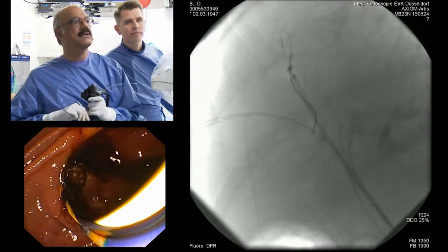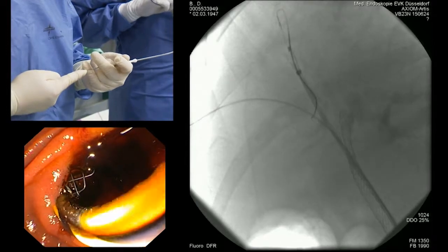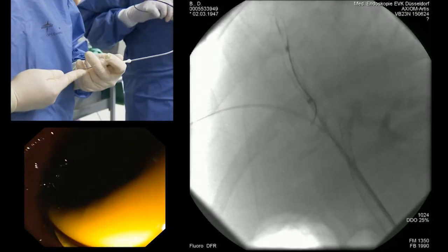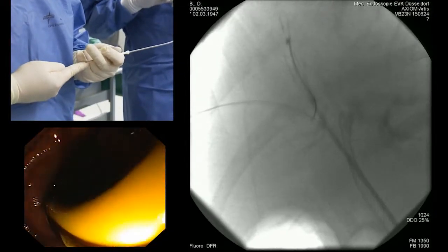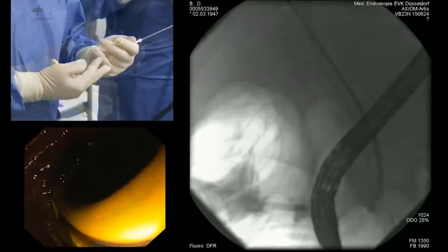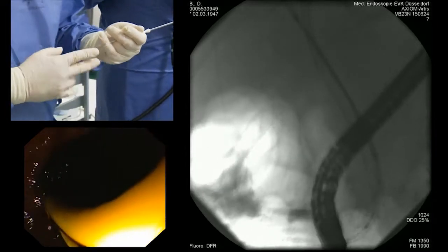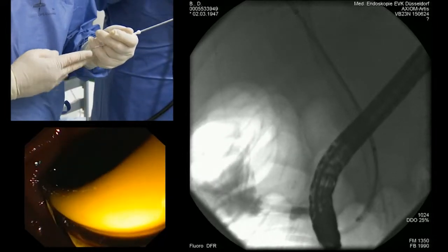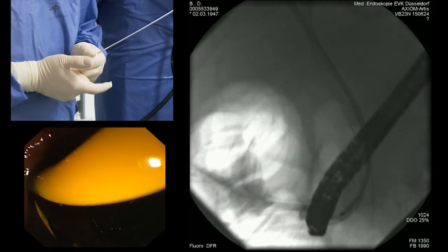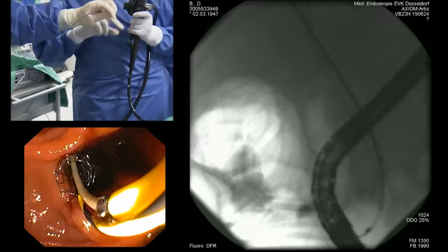Ralph is going to open the stent now. I am not concentrating on the top part at all — I am concentrating only on the endoscopy area to see that I place it in the right way, constantly checking that. When I come to the second lower marker, I am going to put everything in position and then ask Ralph to completely deploy the stent. Now we have deployed this stent — you can see both stents are outside the papilla.